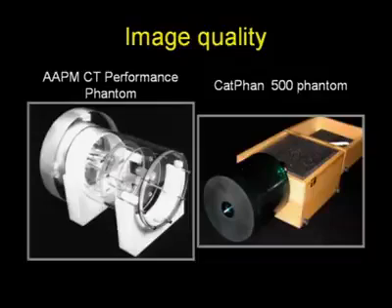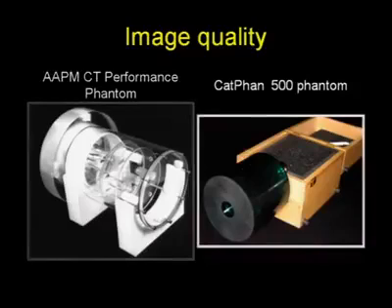So again, all of these parameters can be acquired and analyzed using commercial phantoms that are out in the field. And in this talk, I'll be focusing on the CatPhan 500 phantom just because I'm more familiar with it. But anything off the shelf will do.